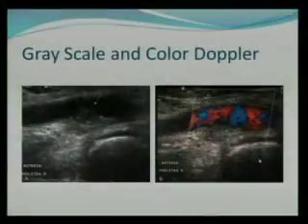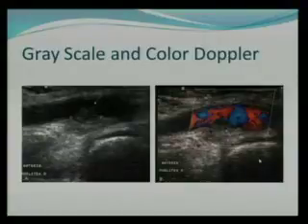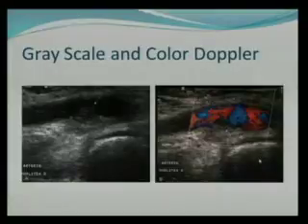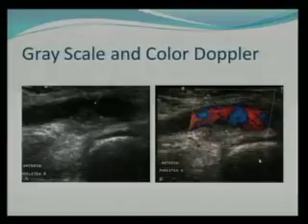All right, so this is the grayscale. Now what happens when there is a clot like this within the popliteal artery? Two things can happen. Number one, that there can be stenosis of the popliteal artery. But what is this clot doing? The patient doesn't know the patient has a clot. Patient is walking, talking, dancing, whatever. He's showering emboli, distal emboli, into the distal digital vessels, into the infrapopliteal arteries. And by and large, over time, unknowingly, he may have showered a wide variety of clots distally.